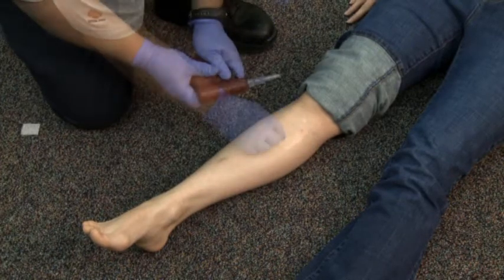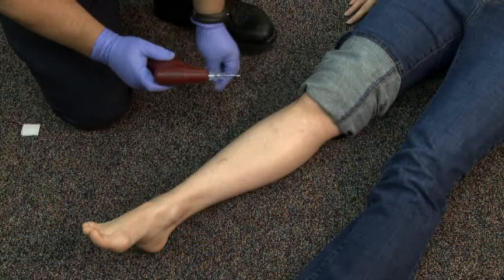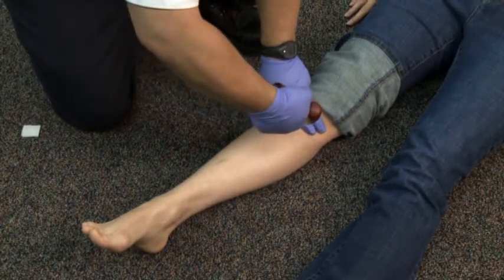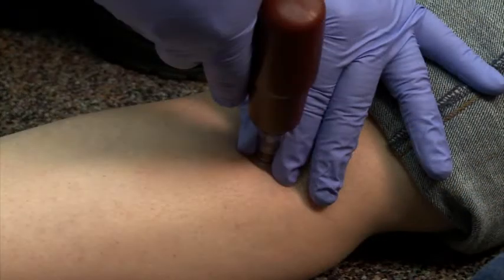Holding the drill at a 90-degree angle to the tibia, activate the drill and insert the rotating needle through the skin and into the bone cortex. A pop will be felt upon entering the bone cortex, and a lack of resistance against the needle will be felt. Release the trigger of the drill.